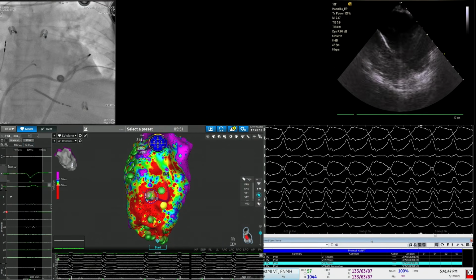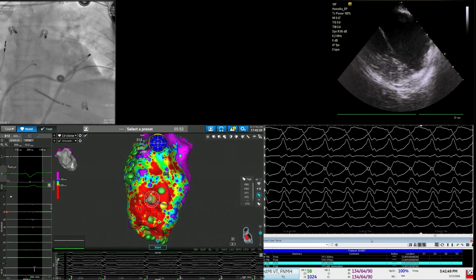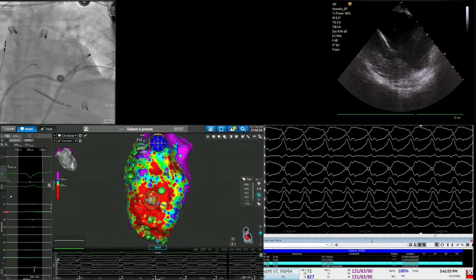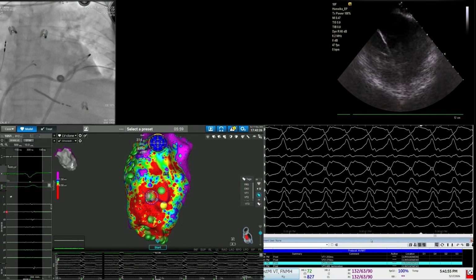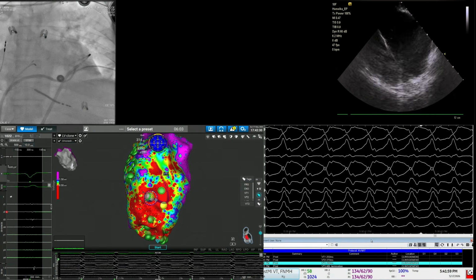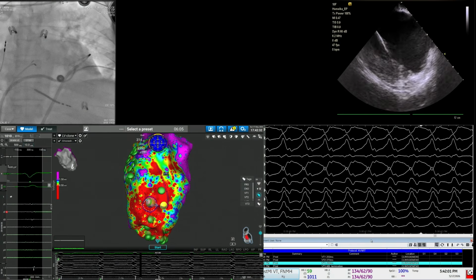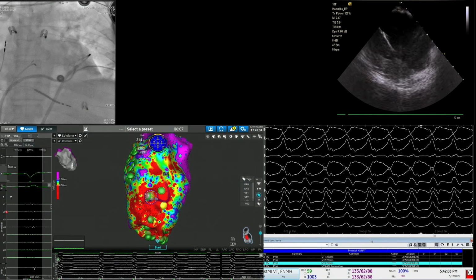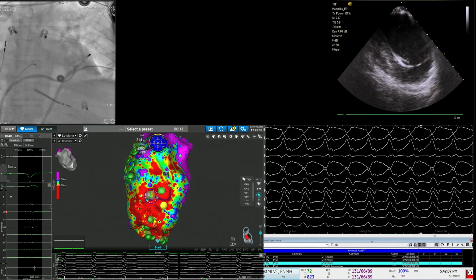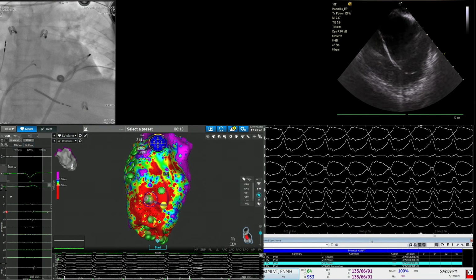So, when we pace further down into the scar where my catheter tip is, the morphology was completely off. So we couldn't rely on pace mapping with a long stim to QRS. Those kinds of approaches were clearly not going to work. For technical reasons, we're not able to do functional mapping here. So what we decided to do was to induce VT.